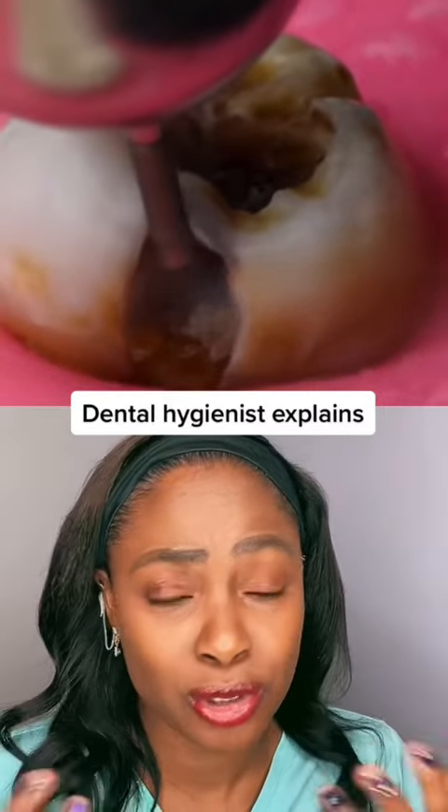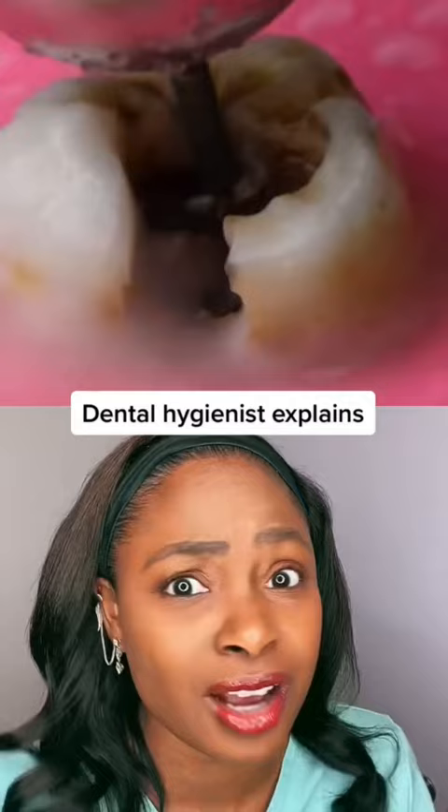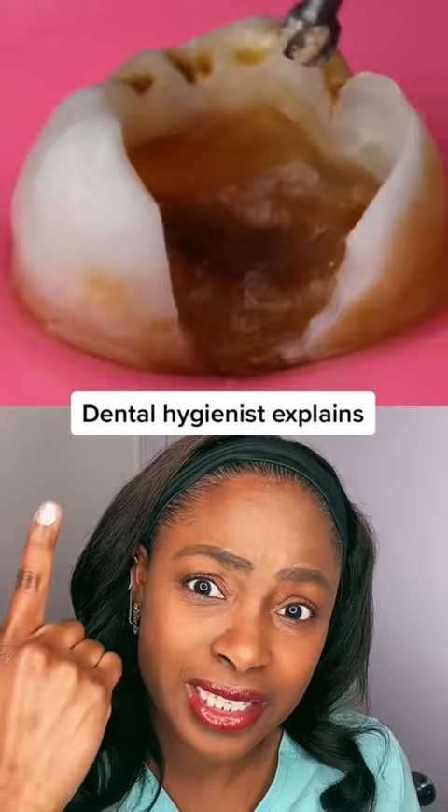Don't let this happen to you. You can see this tooth has a huge hole on the side of it and under the top of it, and it's being cleaned out and repaired right now. Thankfully, you can see that this pink thing around the tooth — that's actually called a rubber dental dam — and it's preventing anything from falling into the back of the mouth.